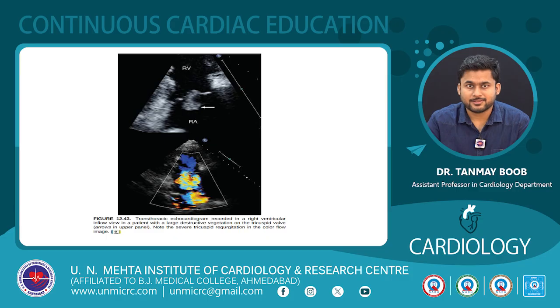This is transthoracic echo recorded in RV inflow view. As demonstrated, the figure is demonstrating the large destructive vegetation on the tricuspid valve leaflet in the upper panel, which has caused primary severe TR, as shown in the color Doppler view in the second image.